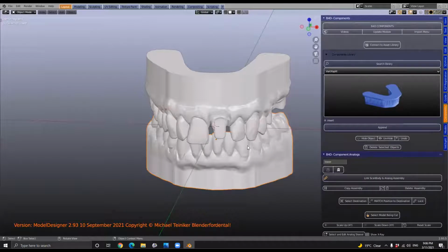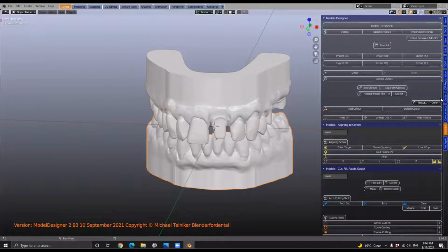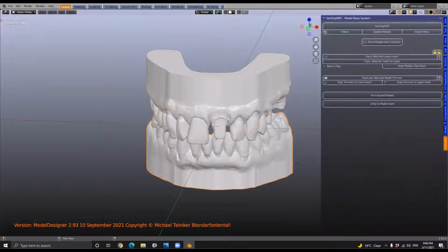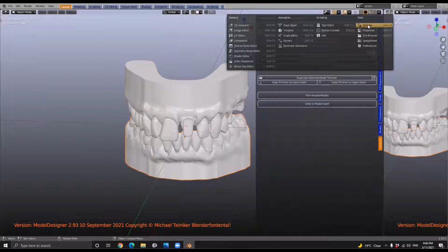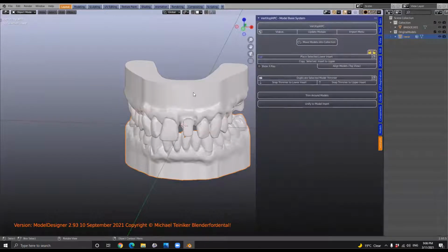All right, so we always start with the blue insert, but one thing that we have to do is put these things into collections, and this is vitally important, and I'll just open that up. That's because we need to link these models, because when we're doing the cutting and everything, we want everything to happen in one go. Of course we need a name for these models, because at the moment it's called Bridge 01, so Blender's not going to find it.